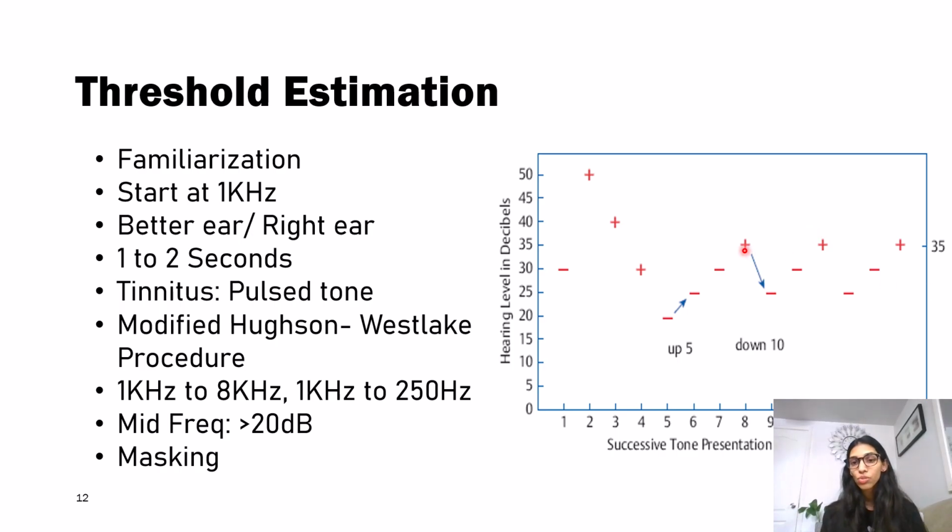In this case, if you see 3 times, we've got the threshold at 35 dB, the minimum level where you get the response 3 times. Usually we start with 1000 hertz, go up to 8 kilohertz, that is 1000 hertz, 2000, 4000, and 8000. Come back to 1000 hertz to test whether the responses we've got are correct. Then go to 500. This is how we track the threshold.